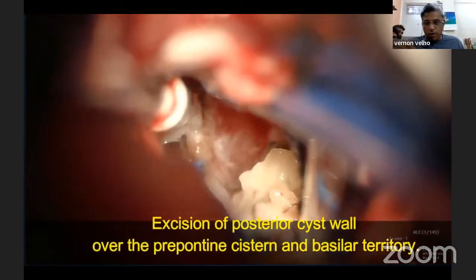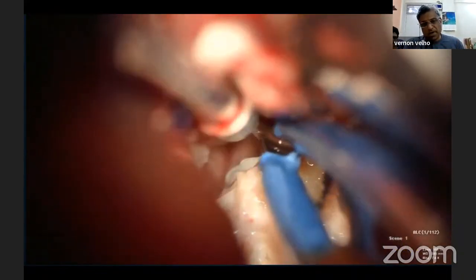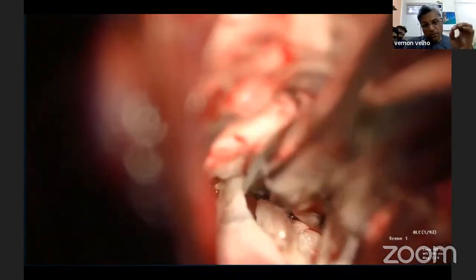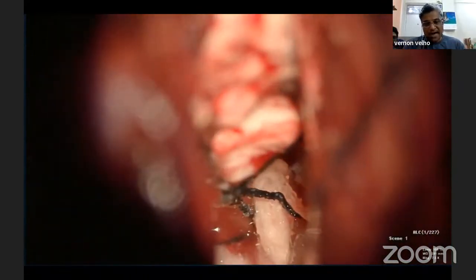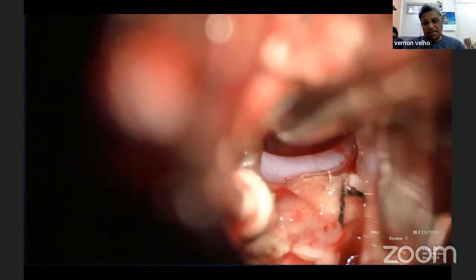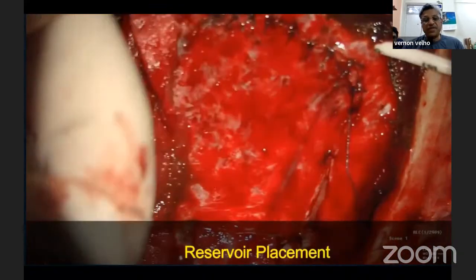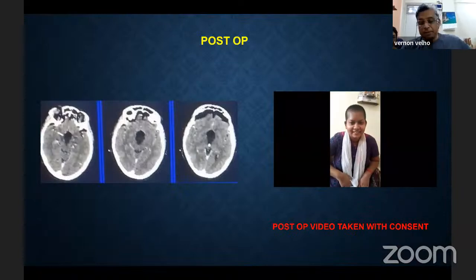And if you see, when you don't have retractors, you have more place to put your instruments. You can gradually have more control and always use foot magnification. Because once you have your retraction with your hand and with your bipolar, it's very difficult to control the focus. Here you are seeing the PCA, the SCA posteriorly. And that's after removal of the tumor, a complete closure. That's the post-op scan. That is the patient.